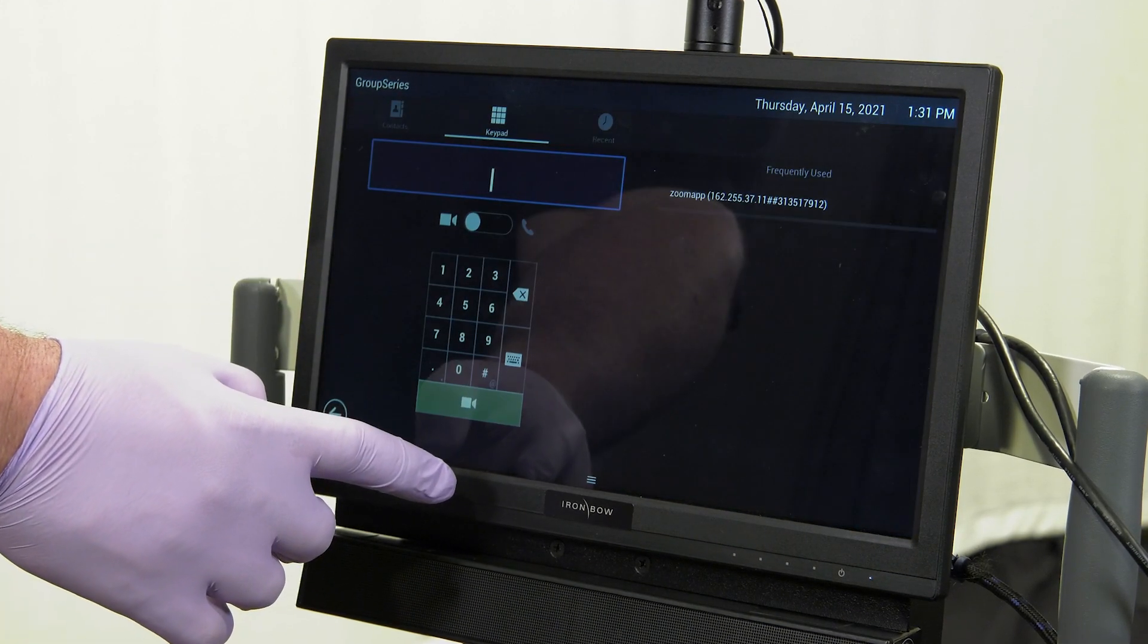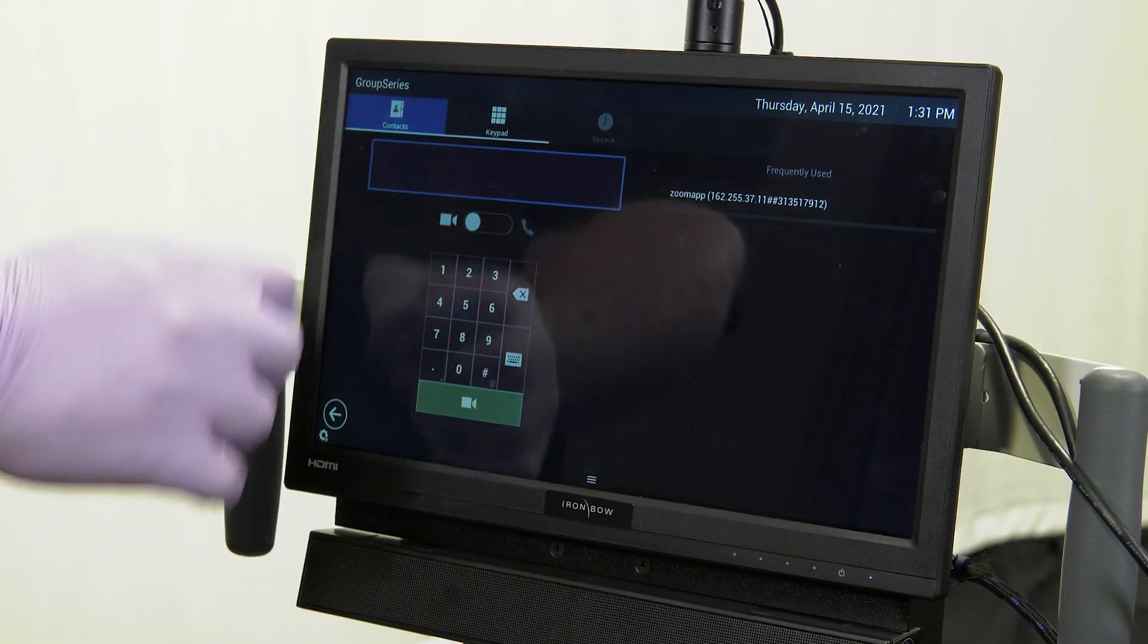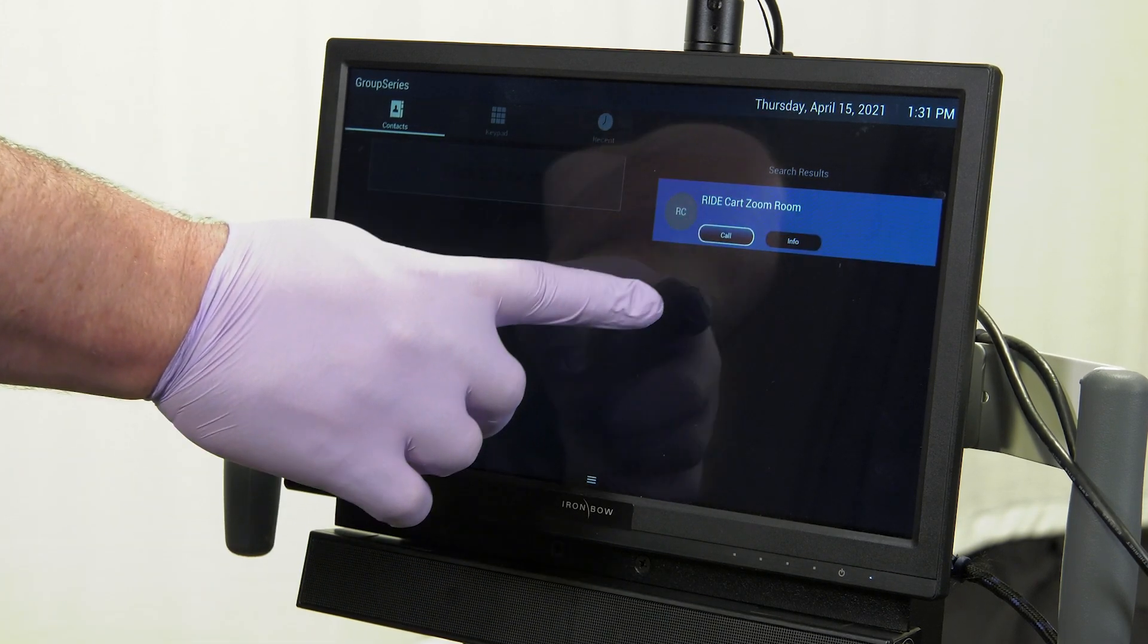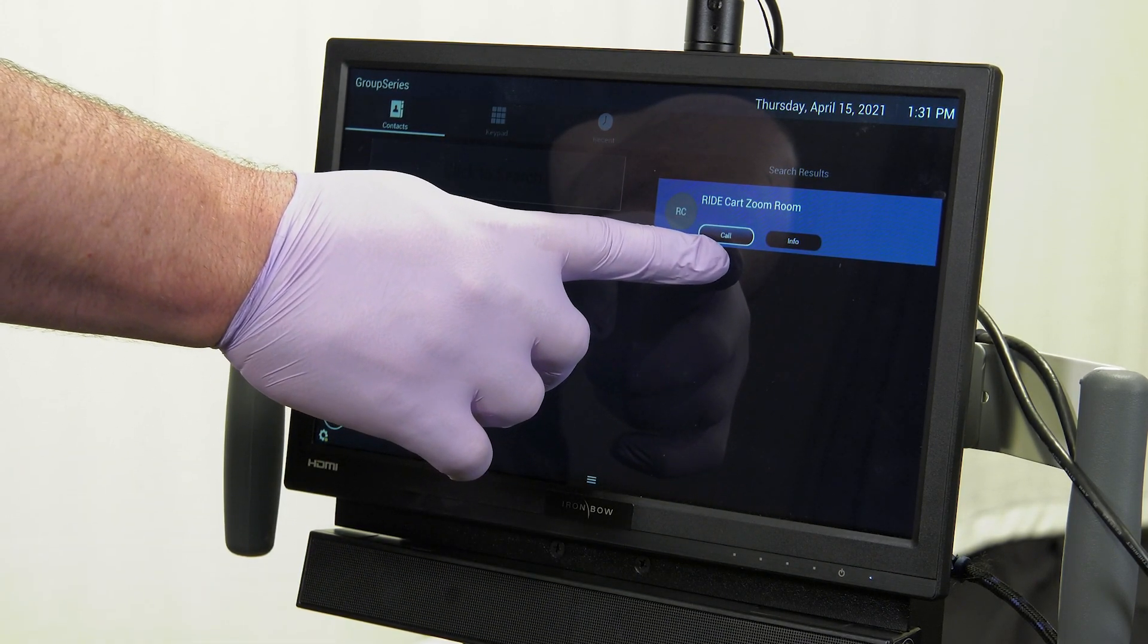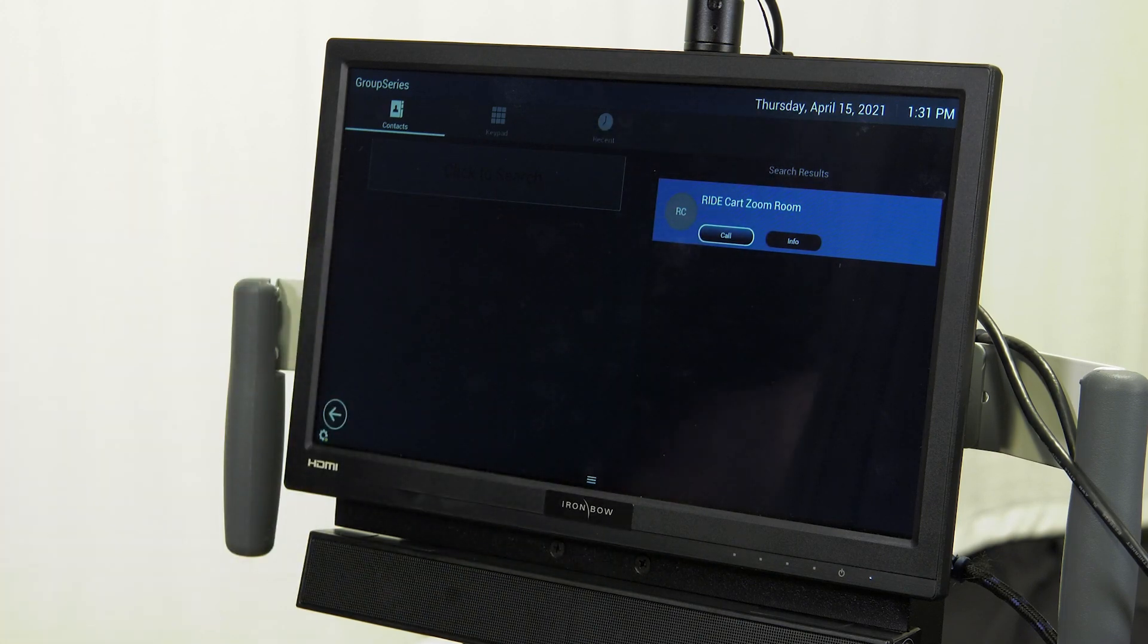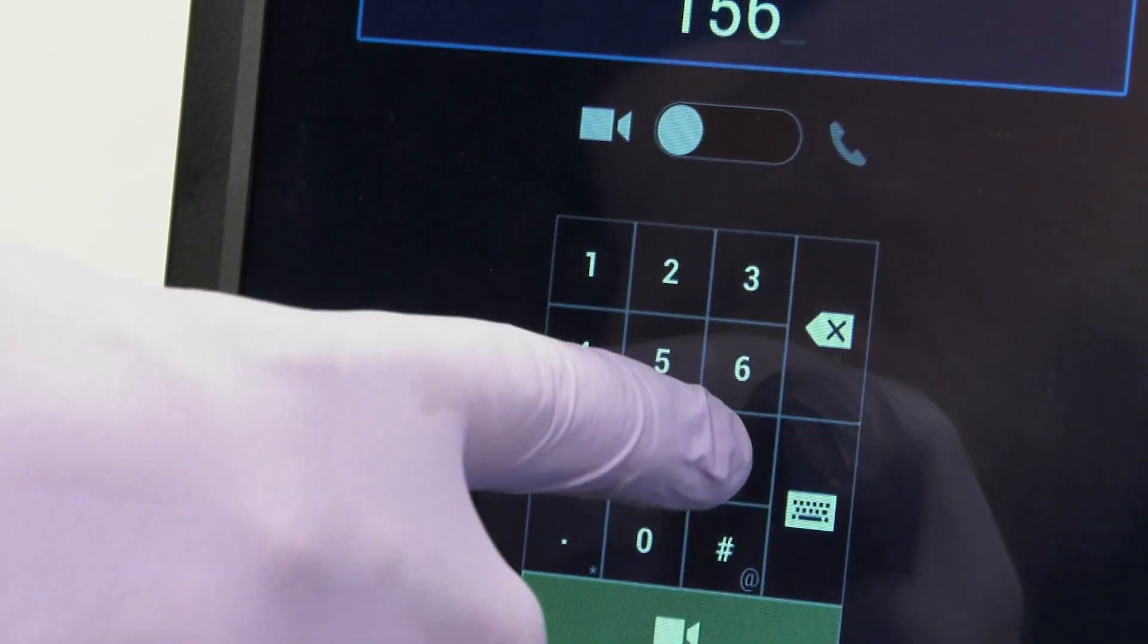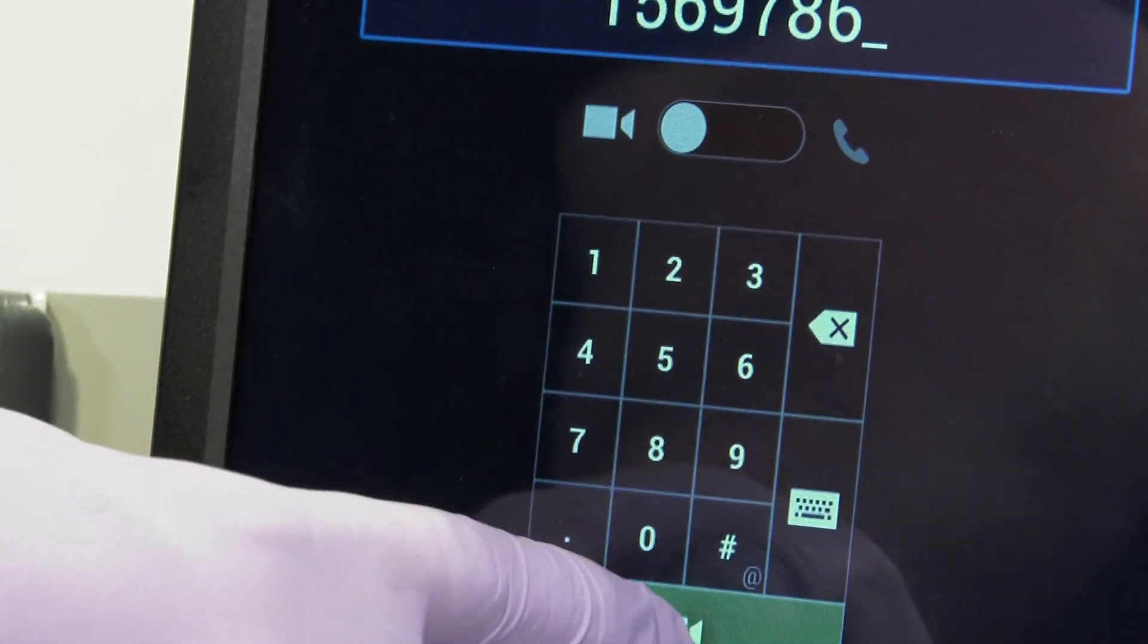If you have the address book set up, you should see a list of rooms you can call into under Contacts. Tap the Call button of the desired Zoom room to join. Otherwise, enter the dial number of the Zoom room using the keypad. Once called in, you will be prompted for the meeting ID.